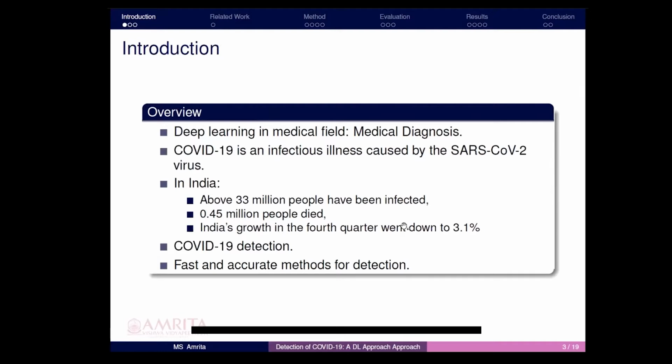Deep learning methods are largely incorporated in many medical fields, especially in medical diagnosis. Deep learning techniques could find patterns in images that can be attributed to various diseases. The main challenge in applying deep learning techniques in the medical field is the lack of availability of quality labeled data. Machine learning approaches such as one-shot learning methods are becoming increasingly popular in the medical community because they perform better with limited data.